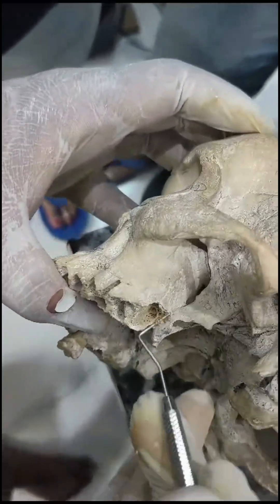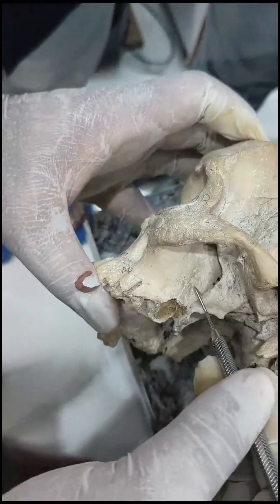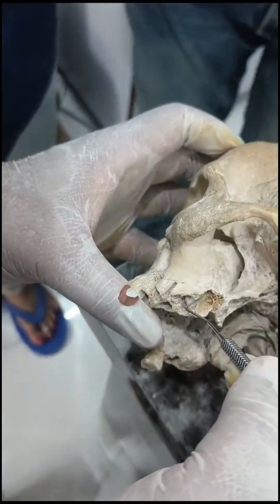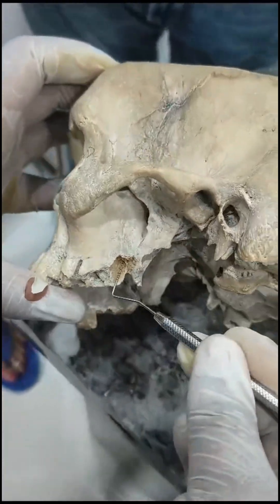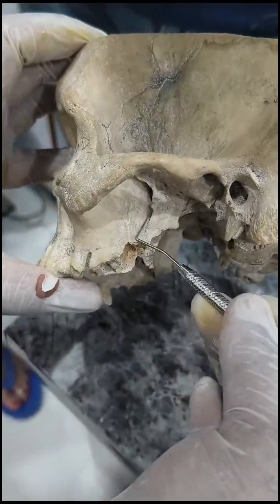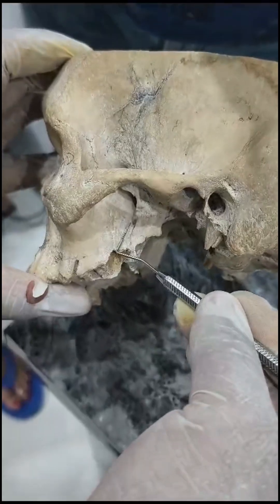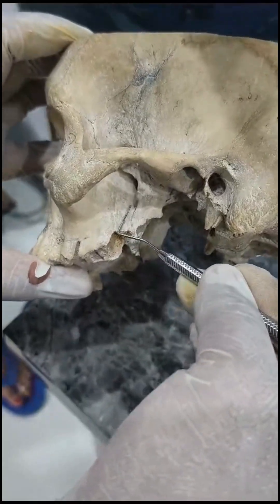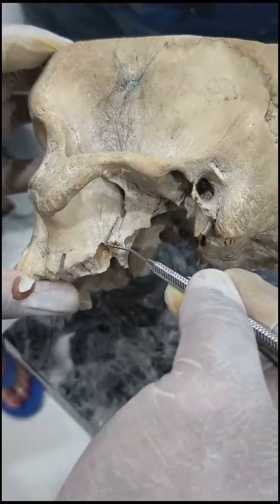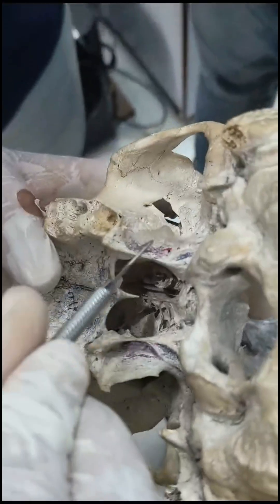This is an important anatomical restriction for pterygoid implants. Our implant should never be angulated straight towards the pterygo-maxillary fissure — if pointed that way, we will never engage into the pterygoid fossa.